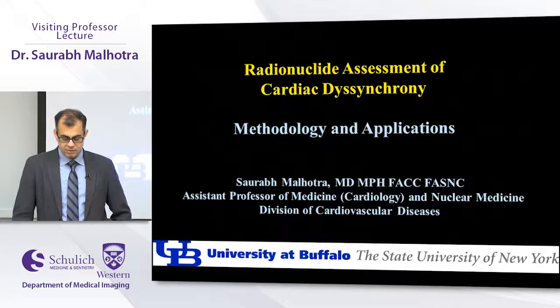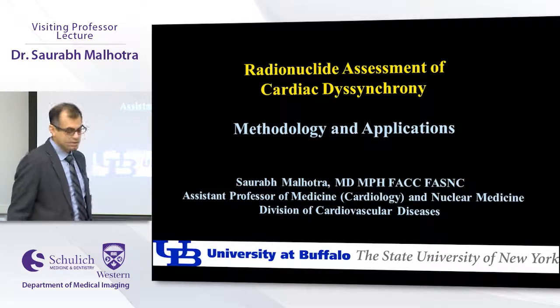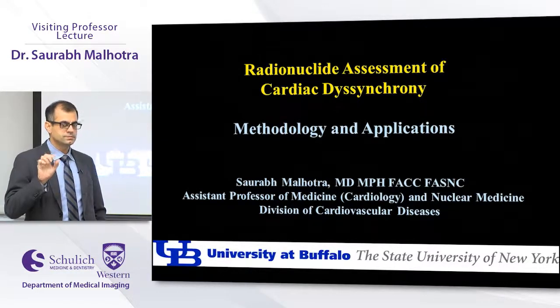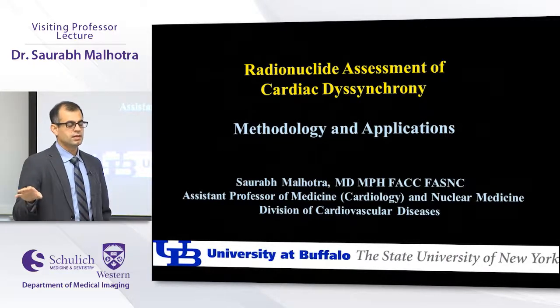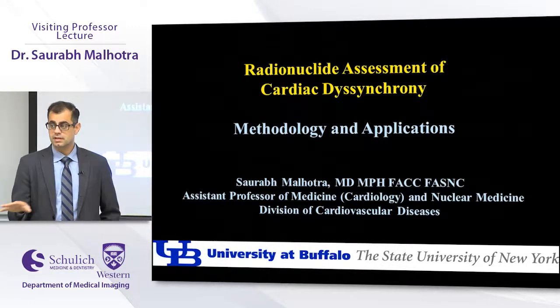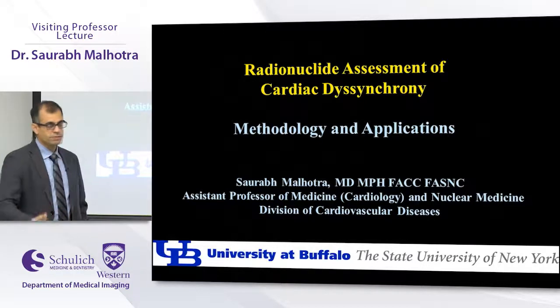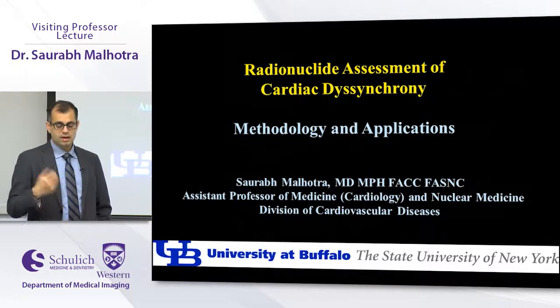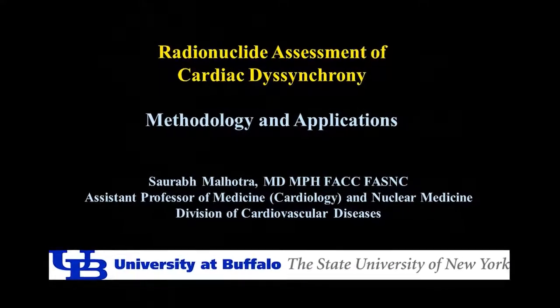All right, so we're going to go ahead with the presentation on radionuclide assessment of cardiac dyssynchrony, methodology and applications. I'm going to first talk about dyssynchrony in general. It is somewhat technical, and dyssynchrony didn't start off with radionuclide imaging, at least from a clinical standpoint. And now it has picked up with radionuclide imaging. I'm going to show how we can do it, what extra information we get, and how we can apply it or start applying it on a clinical basis.